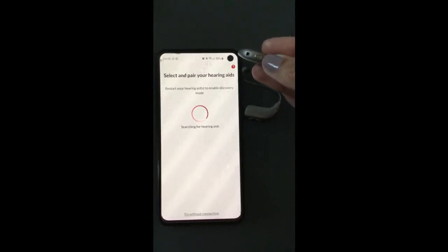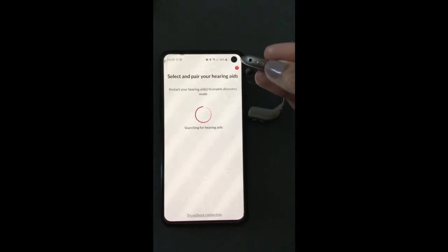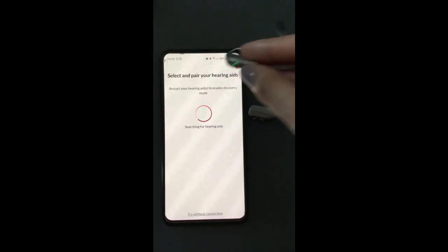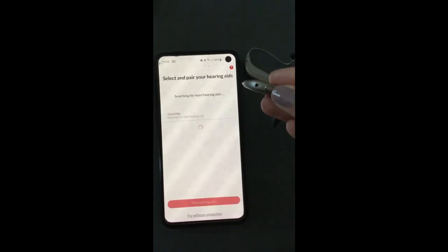If you have a rechargeable hearing aid like I do here, you need to hold down the bottom button until it flashes red to turn off, and then hold it down again until it flashes green to turn back on.